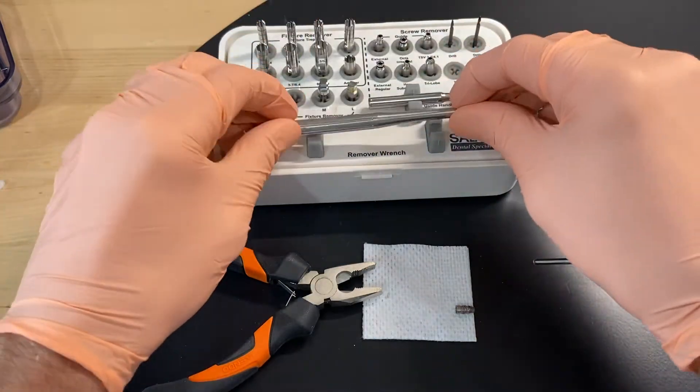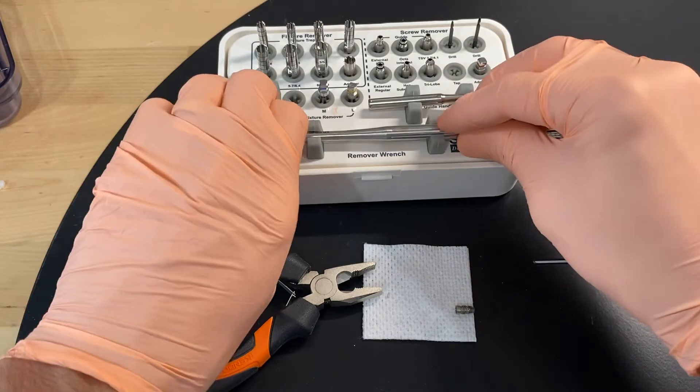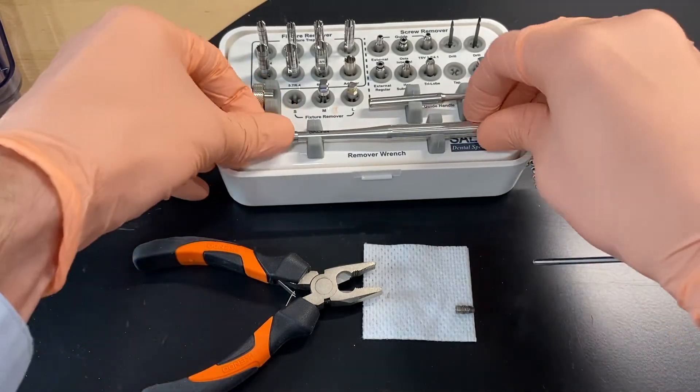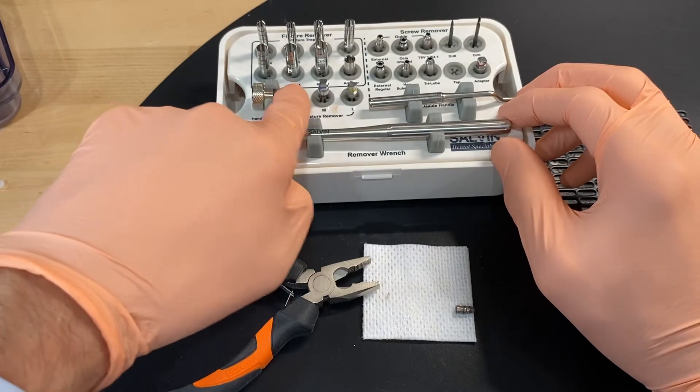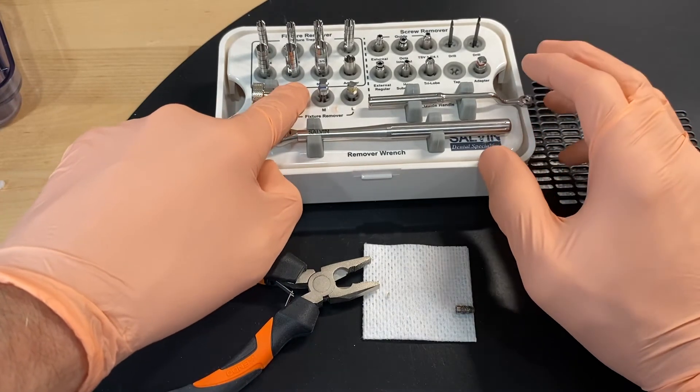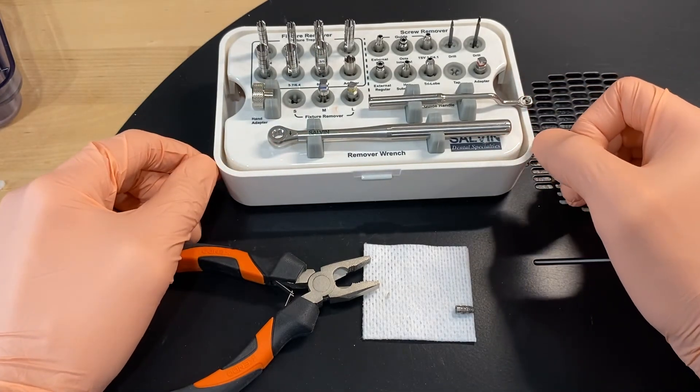Put that back in the kit, set the wrench back in, and then inspect your kit. Looks like we've got a missing small, and we did have that fracture, so we're going to order a new one of those, and you're good to go.